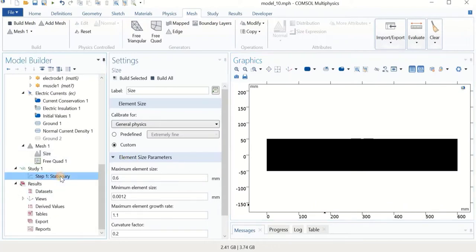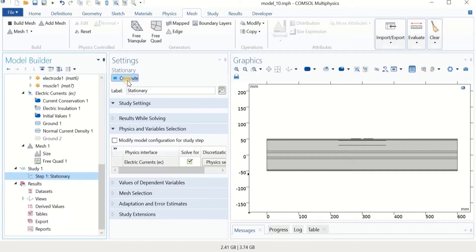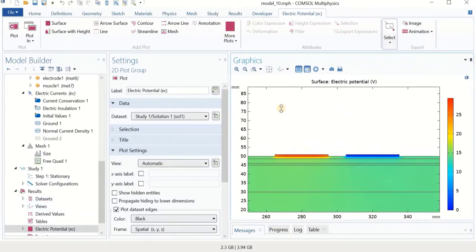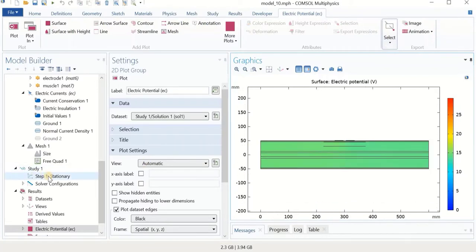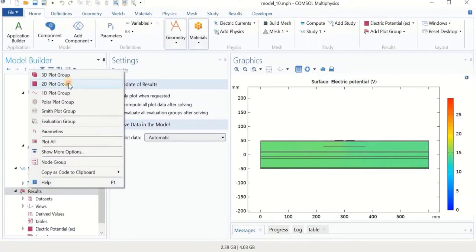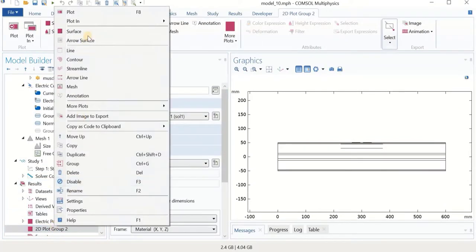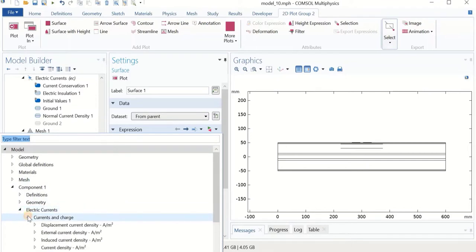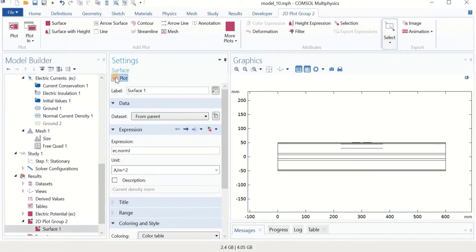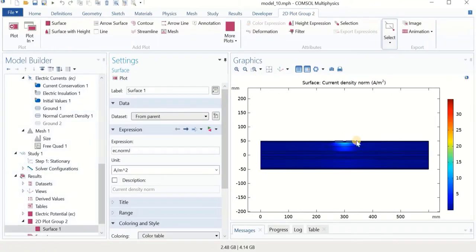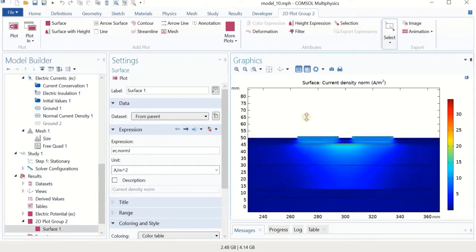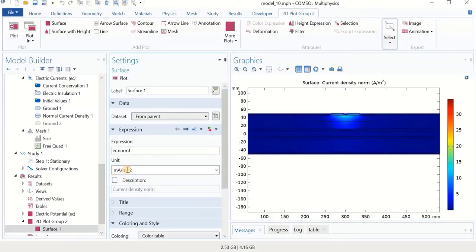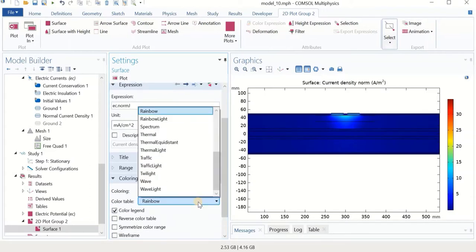We go to study — we have the stationary study and don't need to change anything. Click compute and wait for solving. The problem is solved and we have electric potential as the default result. I right-click, add to the plot group, right-click surface, select current results, go to current and plot the norm. I can refine the unit to milliamps per centimeters squared and use other colors. This shows how the current is applied to our system.